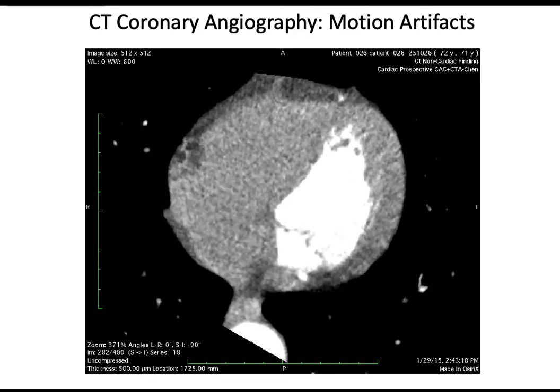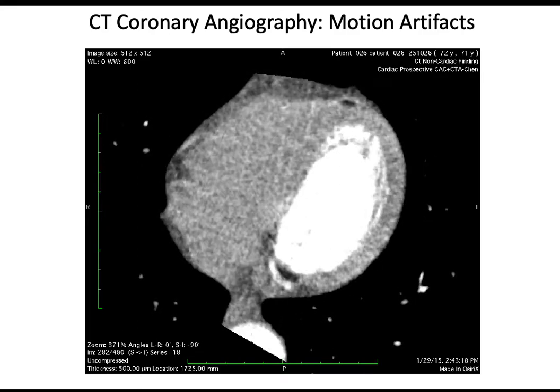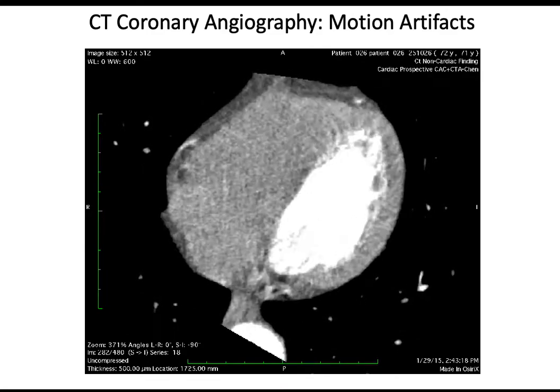Yeah, so instead of exposing the patient to 150 milliseconds of dose, we're now going to scan for a second. So that's 8 times higher radiation dose, if everything is kept constant. So maybe you do that in a subset of patients, patients who have variable heart rates.